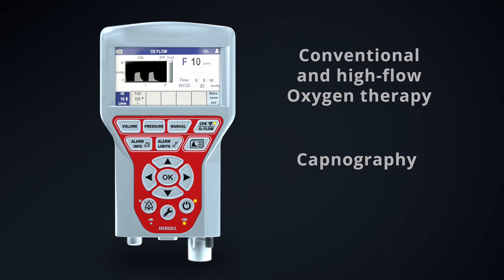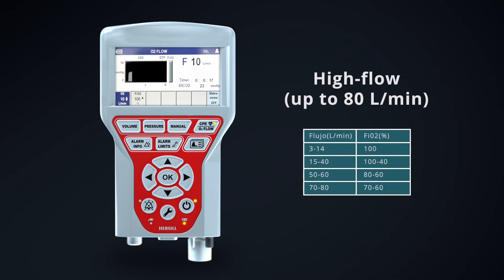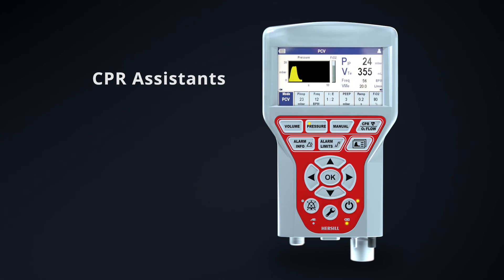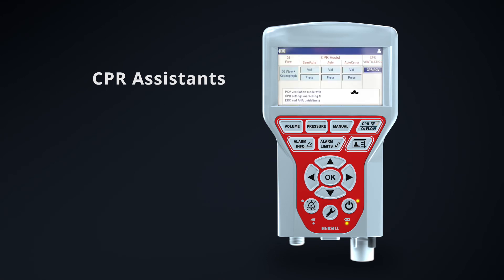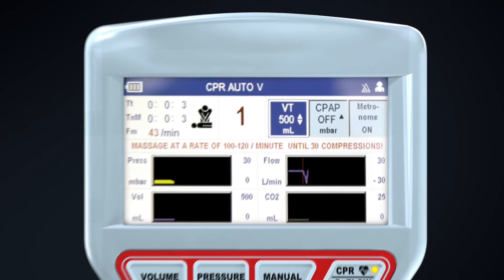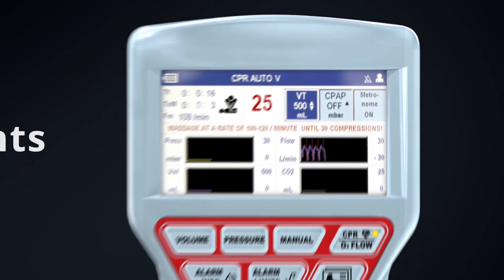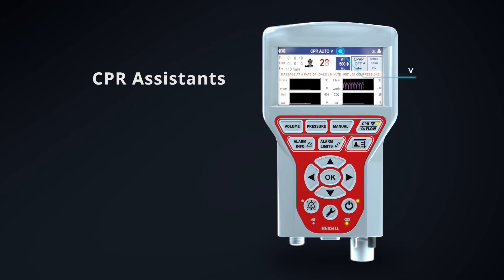We can also administer high flow oxygen therapy. We have several assistants to help during CPR. For instance, in auto mode, the metronome will count 30 chest compressions and the rescuer will then stop compressing. The ventilator will send two cycles in a row, in this case controlled by volume.